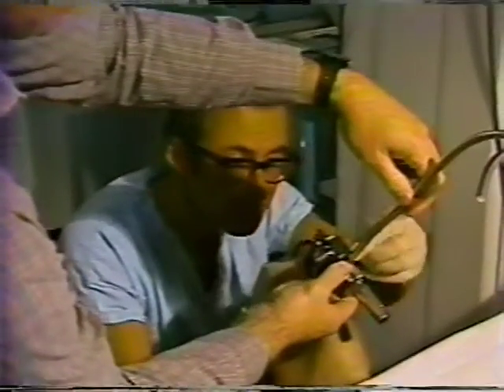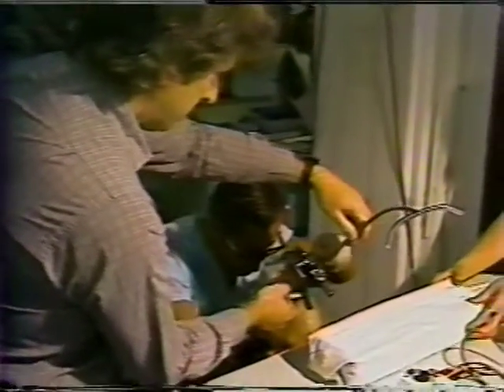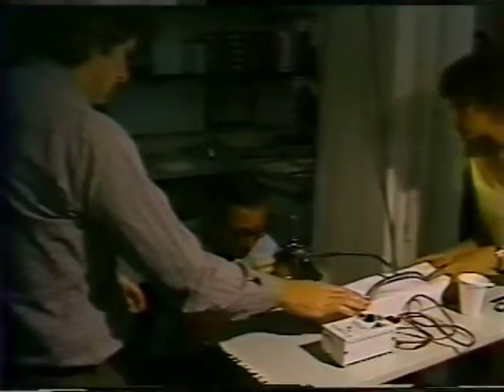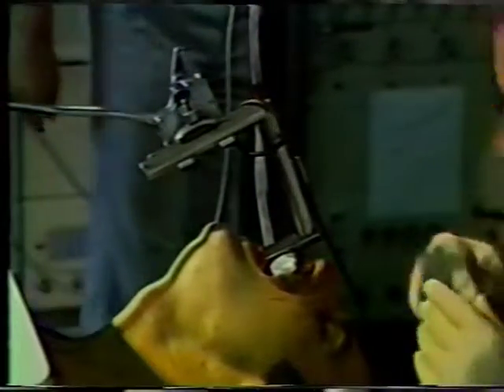A laryngoscope holder is attached and is cranked into position so that the laryngologist is free to use both hands for the subsequent electrode placement. With the subject in this position, the laryngologist observes the tip of the electrode-bearing needle when it enters the airway so he can direct the insertion to the target muscle.